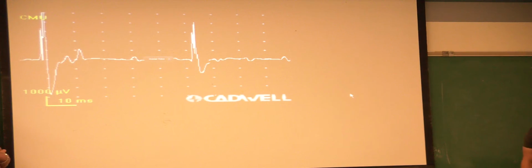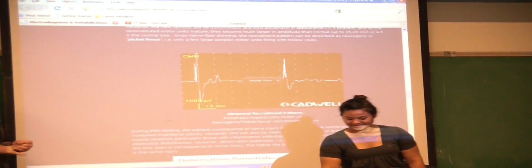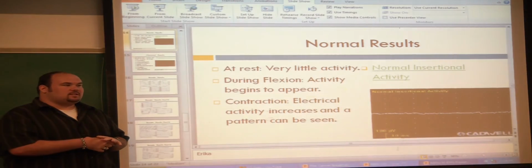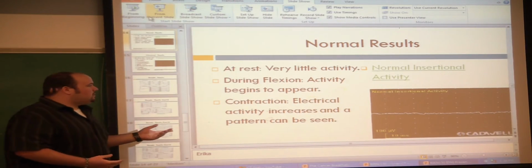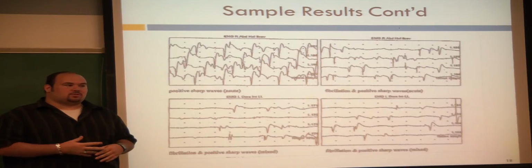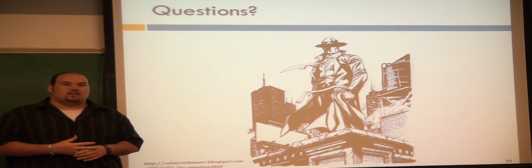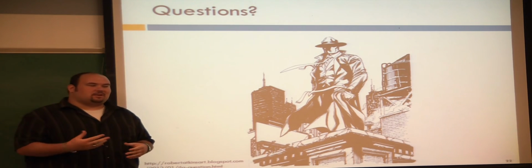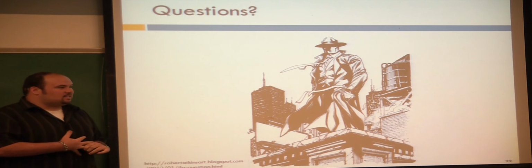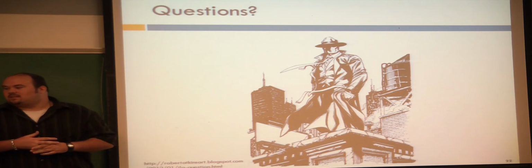That's all damage. And one more actual thing for the EMGs is that, as Angela said, the needle electrode test is actually considered the gold standard. For the patient that we were describing earlier, they actually had the surface electrode, but the nerves were so damaged that the surface electrodes weren't able to get a good reading. So it makes you wonder why you'd even have a needle stuck in you if you can just do it with the surface. And that's actually why, because they can record stuff that surface electrodes sometimes can't.